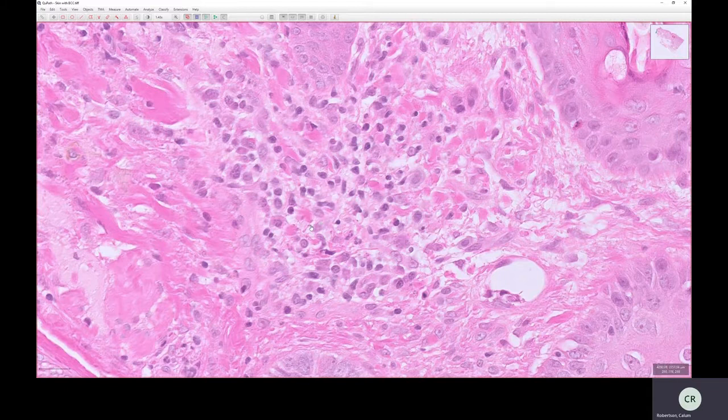So the lymphocytes are, in this section, these inky black dots, or inky purple dots. Here's one here that I'm outlining, and here's another one, and there's another one, and there's more, but lots of lymphocytes, and they're identified by their inky purple nucleus with almost no cytoplasm round about it, and that's the lymphocyte.